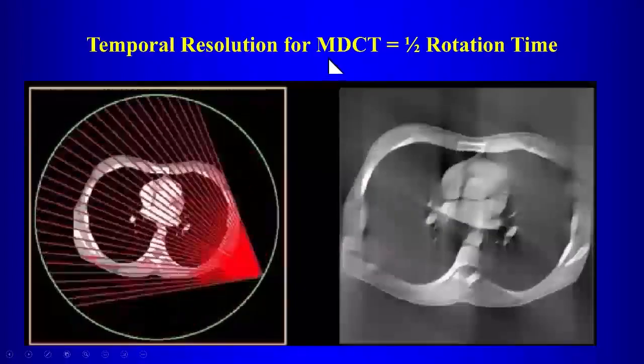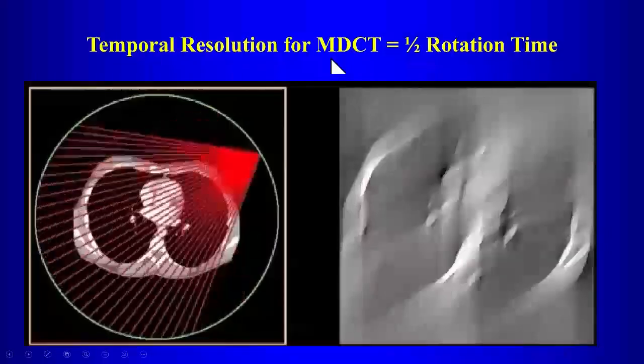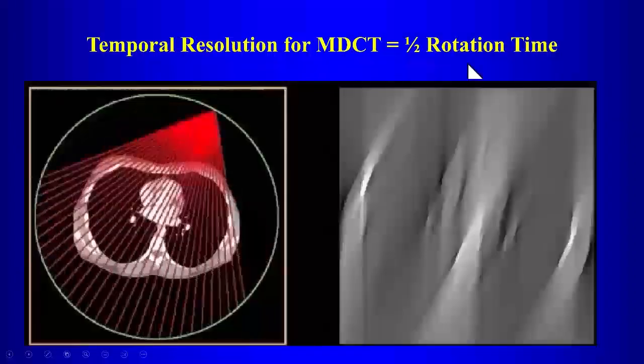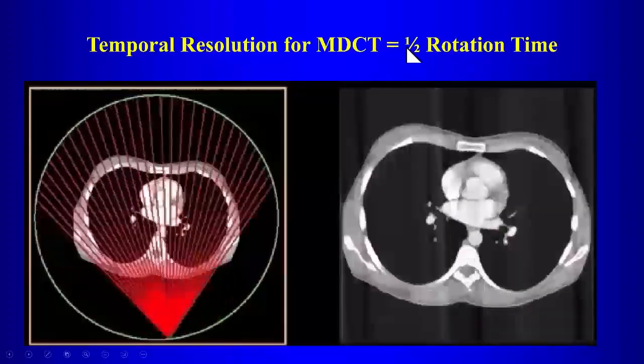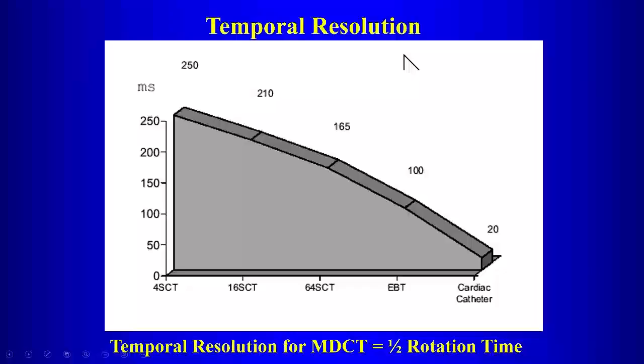So what can you do to improve the temporal resolution? Well, you can make it rotate faster, right? But the problem there is engineering. At some point it flies off and hits the wall. That doesn't work. But there is something else that you might be able to do that some scanners have now, that you can also buy for twice the cost. Add a little red guy that spins around. An extra source. So add an extra source, right? So those are called dual source scanners.